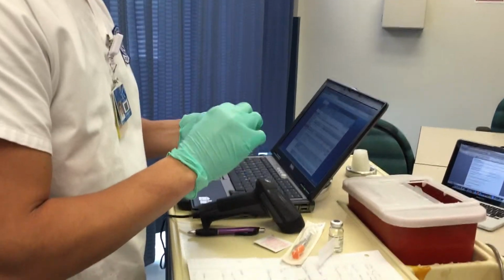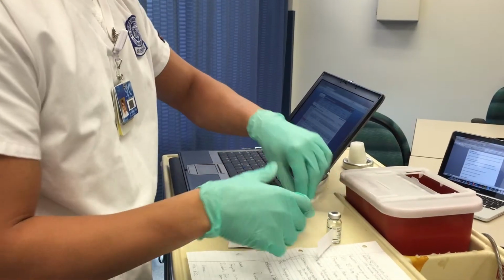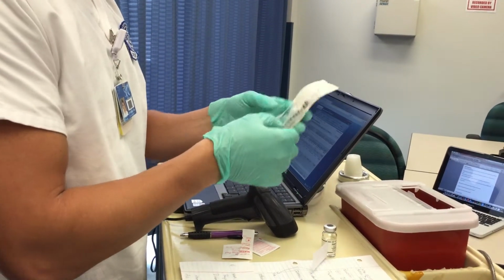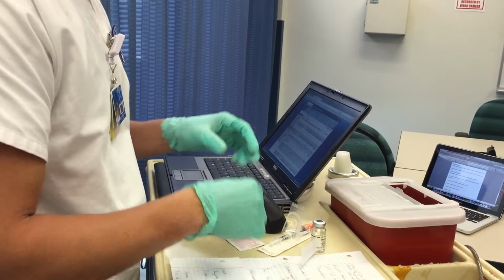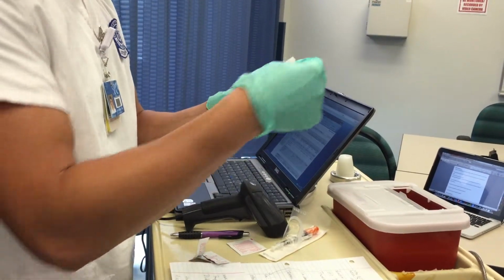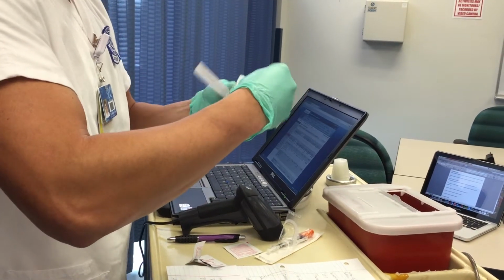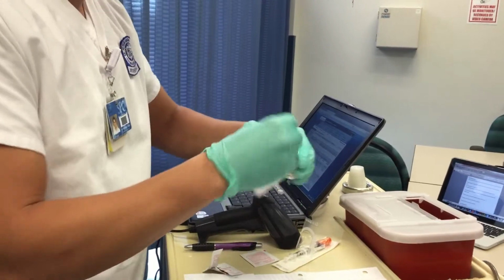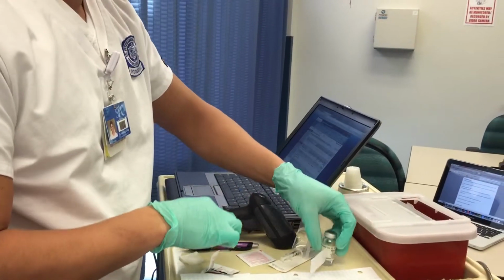Alright, so clean the side too. So I have my insulin ready. I have the syringe ready. I'll clean the top here so I don't contaminate my syringe or the vial. Just clean it.